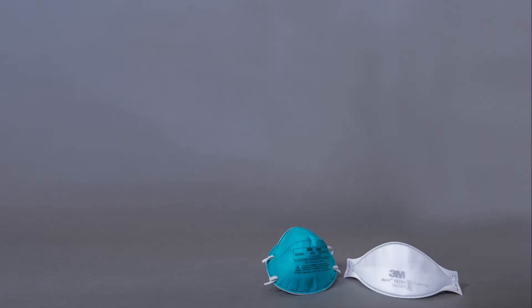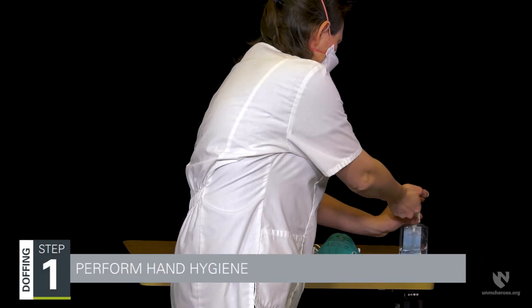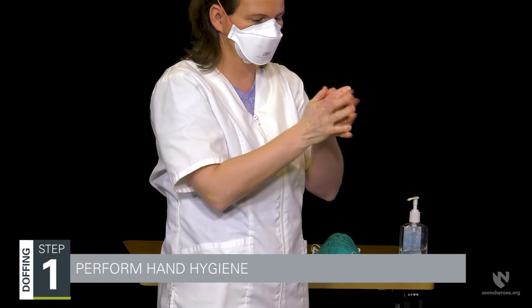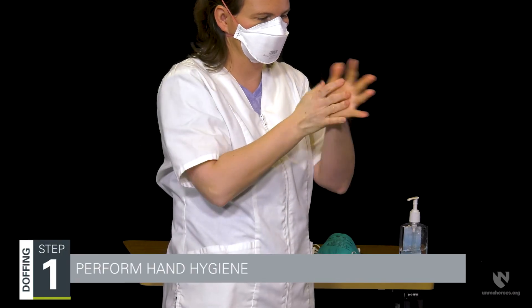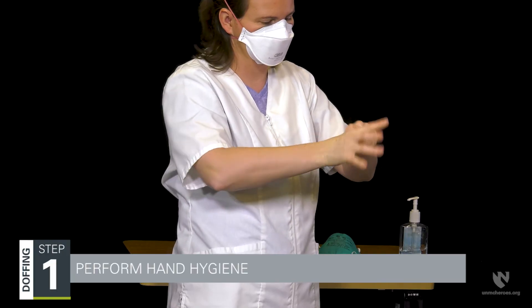The doffing process should be done in a slow, controlled, and deliberate fashion to mitigate the increased risk of exposure related to removing contaminated respirators. The first step is to perform hand hygiene. Hand hygiene is critically important here because gloves are not considered a 100% barrier against pathogens. Hands should be cleaned before touching the head or hair.